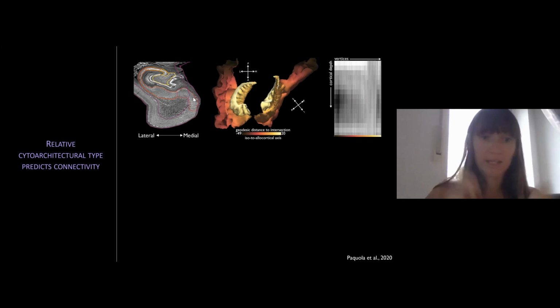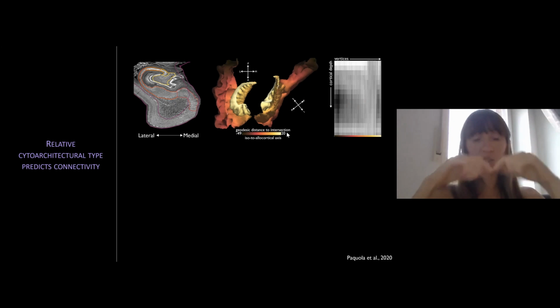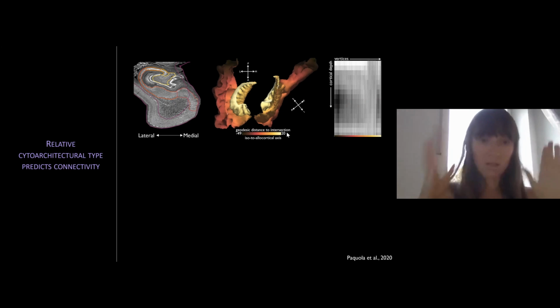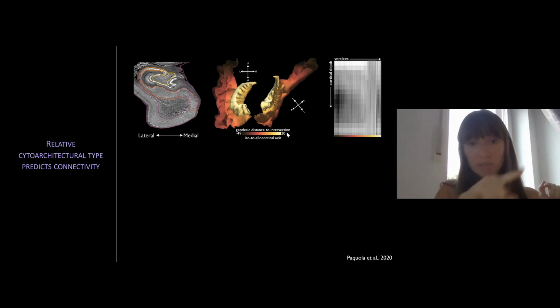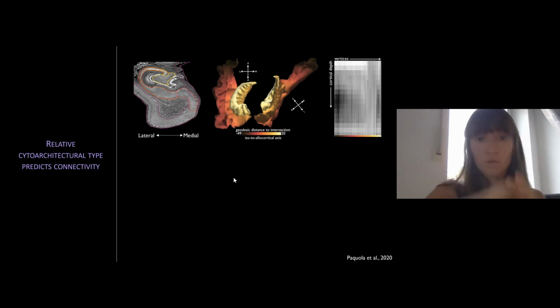So we created a little nifty way to slice off this part of isocortex that skips over the hippocampus and instead link the isocortex to the hippocampus here. So you have this continuous model of the mesiotemporal lobe. That's what you see here. Then at the intersection, we just looked at the geodesic distance along that surface mesh. So we have this geometric measure of iso-to-allocortex. So it really follows the curvature of the hippocampus. So from parahippocampus, entorhinal, kind of going all the way in, it goes through all the subregions and then hits the dentate gyrus. So now we had this really nice new continuous surface model.